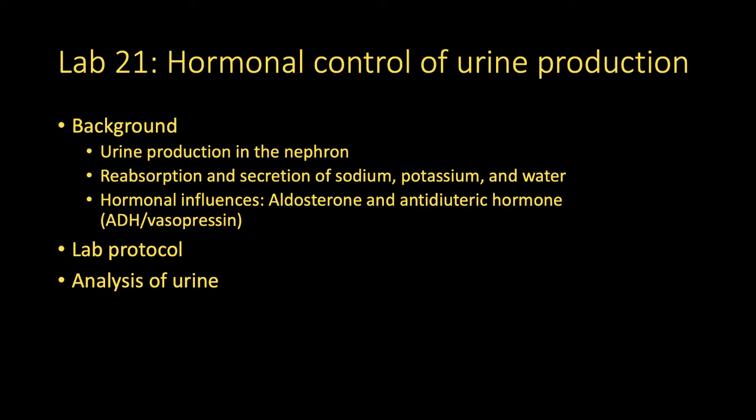We'll go over the lab protocol for how we're going to investigate the hormonal control of urine, how to use dip strips, and just a little bit on how to do a microscopic examination of urine, and I'll show an example of the analysis of my own urine.